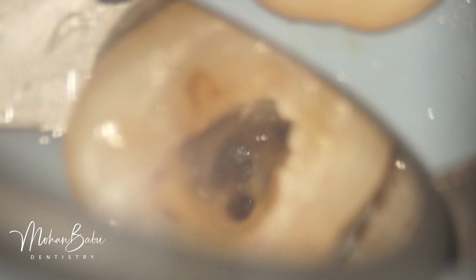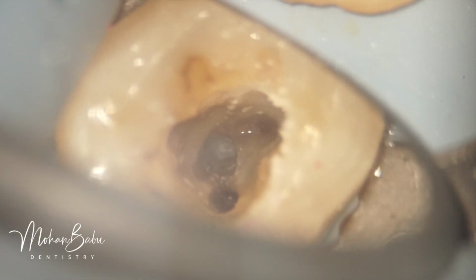So we were surprised. Of course, it's not a surprise. Sometimes the canals join together, but it won't be so big that an instrument can move from one to another. But here they are quite big canals. Big canals have some challenges in terms of retrieval because the instrument can shift from here to there and back to here, so it won't be so easy to retrieve the file.